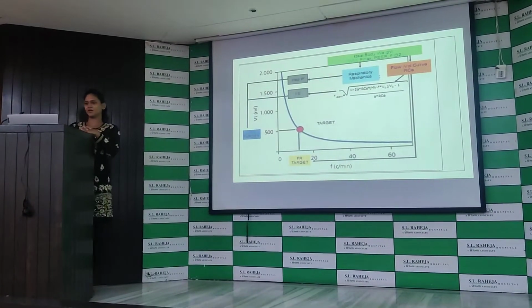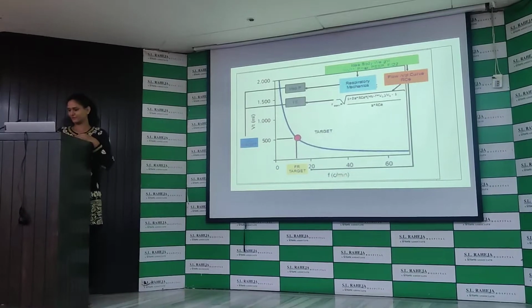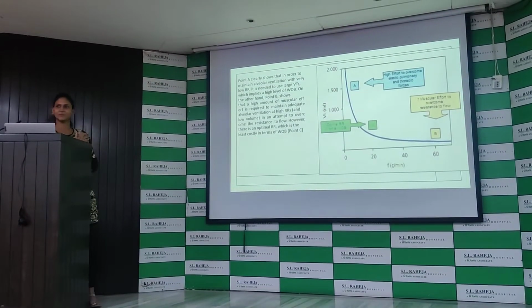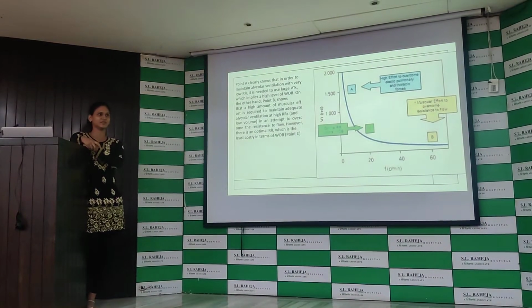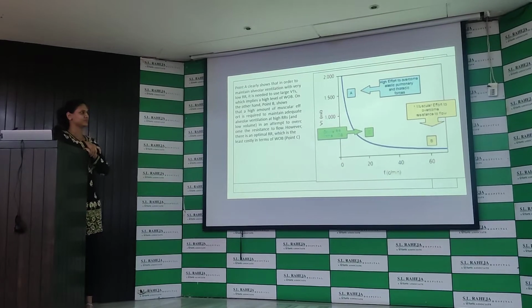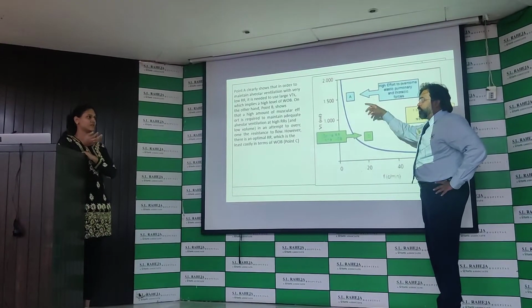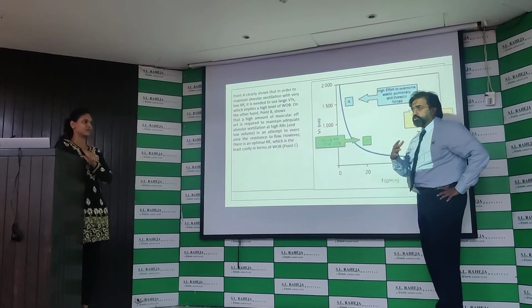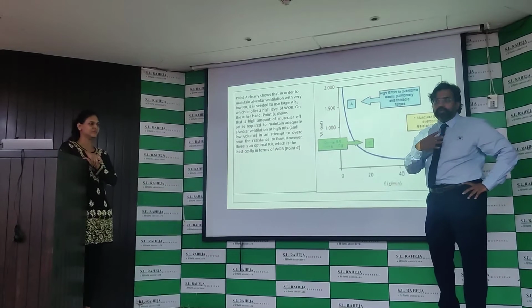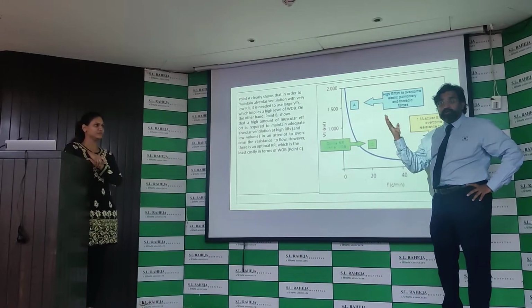Now, this is how the mode calculates. So let's go back to that. You want to understand here that when you are going to point A, you are giving volume to inflate the lung. So how much work does the patient require? This patient requires work to inflate the chest wall and inflate the lung. He has to do both. That's why the volumes required are high, and that's why the work is very high.